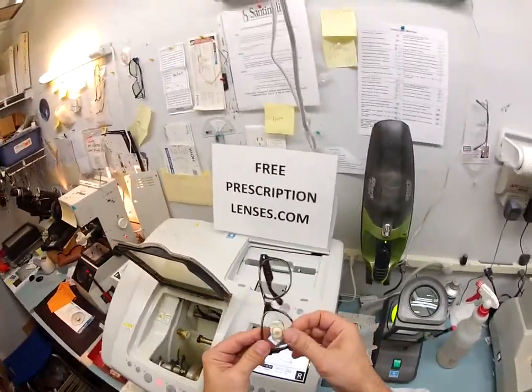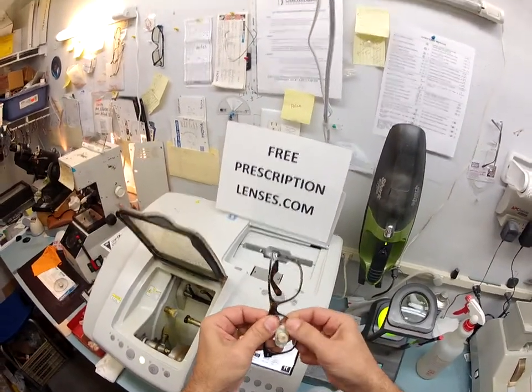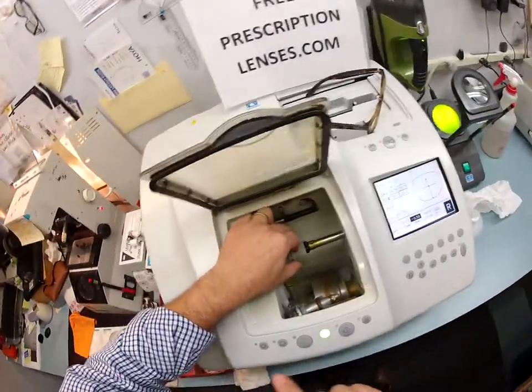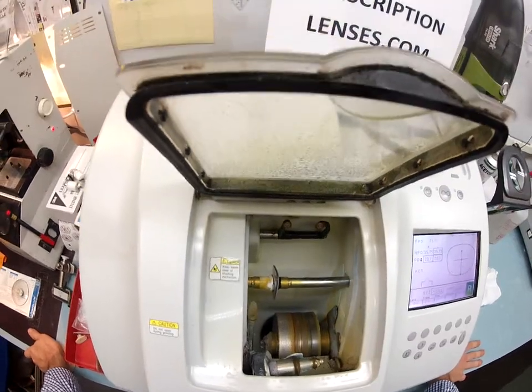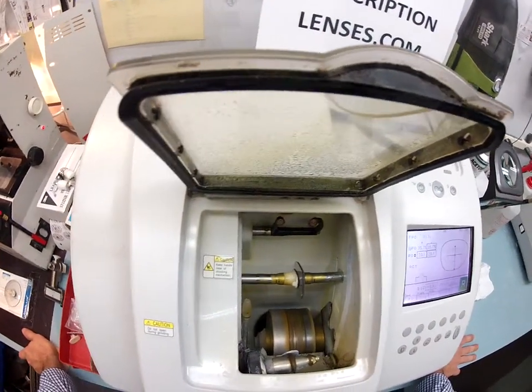All right, so I'm going to tuck it in at the outside corner, and using my thumbs, oops, it's still alive, it's wiggling. Using my thumbs, I press down, nope, it's not going. So I'm going to take another 1/10 of a millimeter off of your lens, put it back into the chuck, and always go a little bit larger. You can always cut more off of a lens. You can never add it back on. The golden rule. So I start large and work my way down.